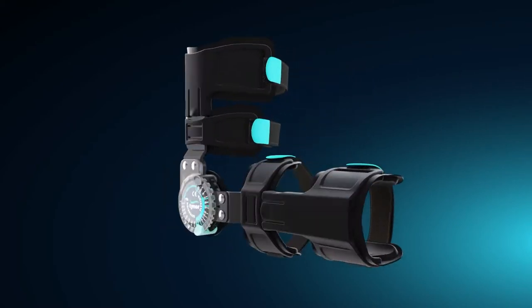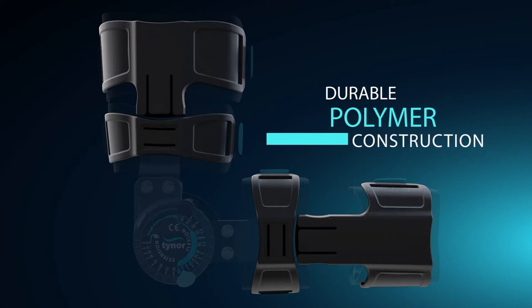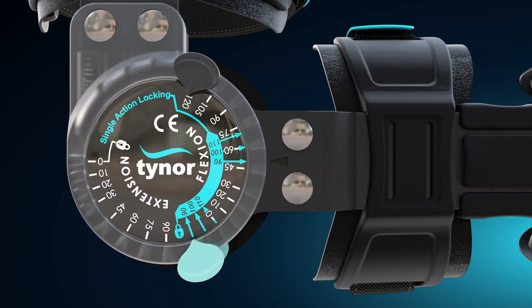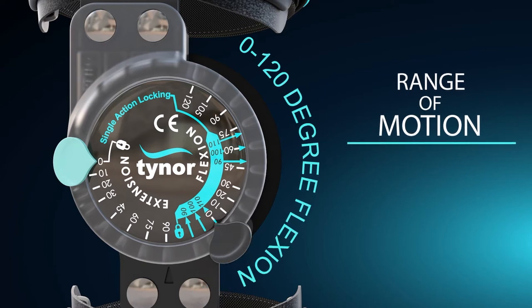Aerodynamically designed, durable polymer cuffs wrap around the arm snugly to give a perfect grip. A very simple to operate range of motion dial has a flexion from 0 to 120 degrees.